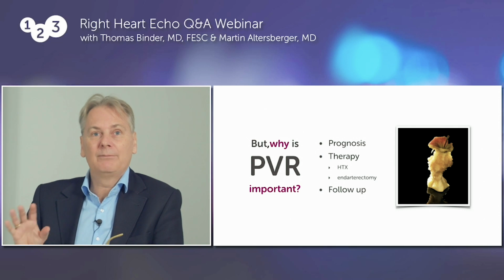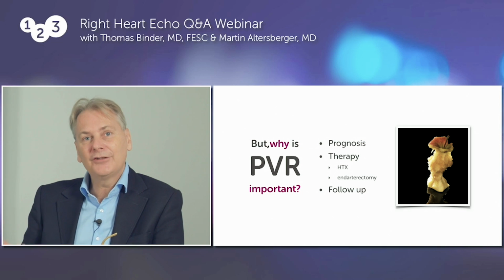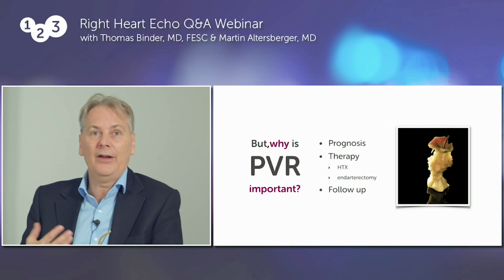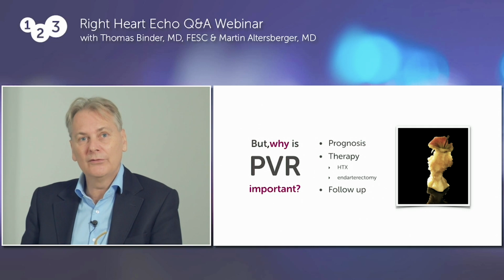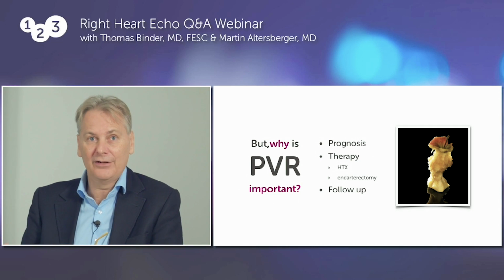Be aware, though, that pulmonary vascular resistance can change, and it can also change with therapy. We know that, for example, if we do a provocative maneuver, if the patient is on the catheter and we give him NO and we see a drop in the pulmonary vascular resistance, we have hope that he is a so-called responder. In other words, that he would respond to therapy. And those are the patients where we initiate pharmaceutical treatments. So a very important way of going about it.